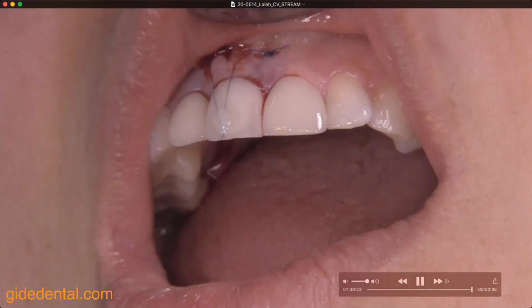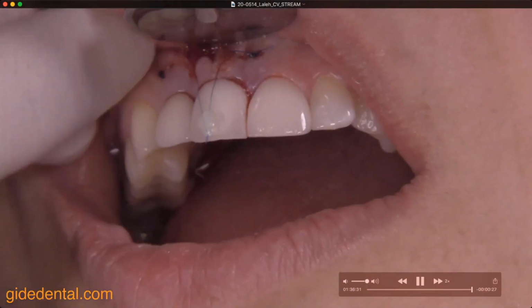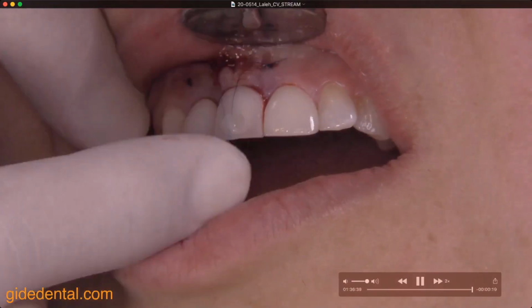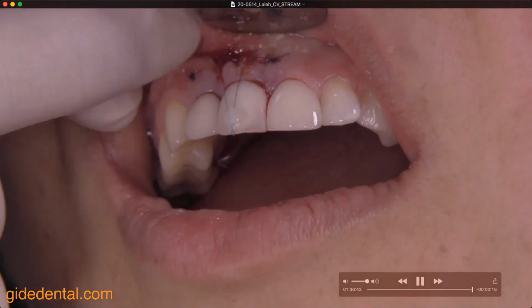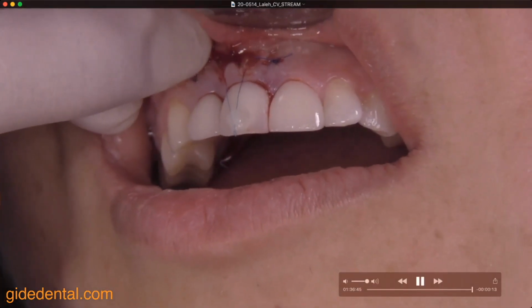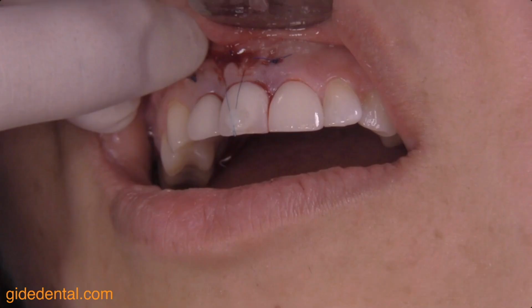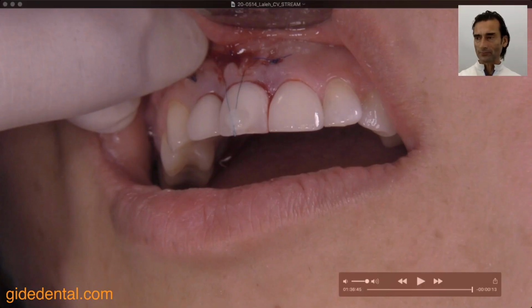Of course, this is maybe a little bit of a disturbance for the patient, but with initially already giving the patient an idea of what this is, and explaining it to the patient, this will be a good way of finishing the case. So by this, we finished the patient treatment.